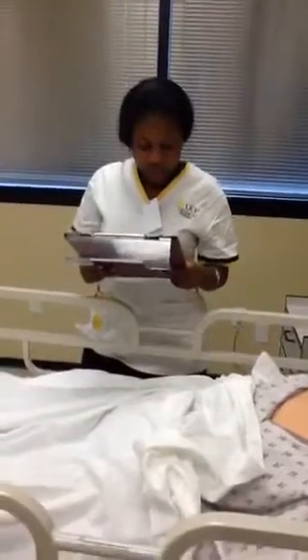Okay, now I'm going to make sure that the patient information is the same as the information on the provider's order, which is Charlie Knight, latex, penicillin, and betadine allergies, and date of birth 08/08/1939. Okay, now I'm done with that. I understand that the symptoms are you have not been able to urinate for over 10 hours. So I'm going to assess the area right now just to make sure that nothing is preventing me from inserting the catheter.